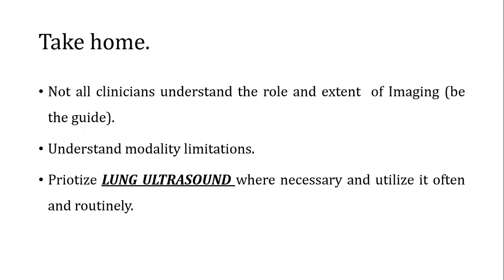Now, why are we doing all of this? Yes, there could be some little bit of cost, but we need to save a life. And saving a life must be informed by evidence. The evidence is showing lung ultrasound is a good supplementary to the chest X-ray. It actually saves you a lot. If we had started right away from lung ultrasound, we would have avoided so much radiation from the CT.